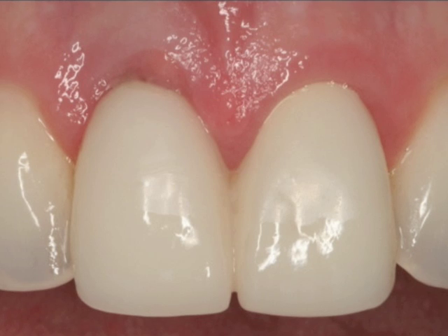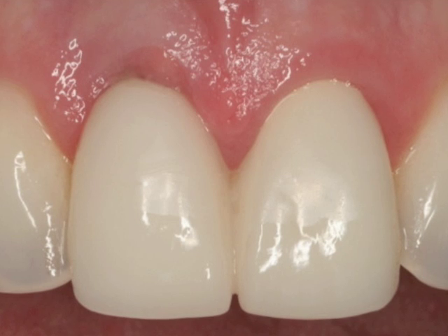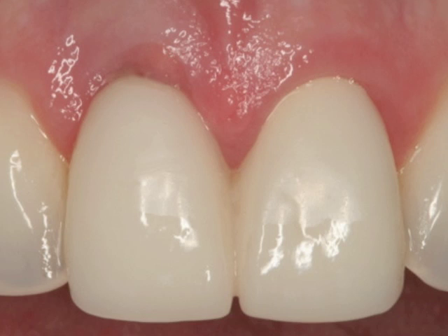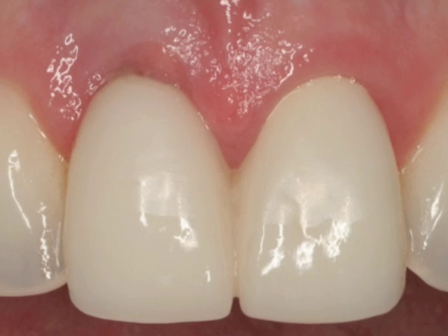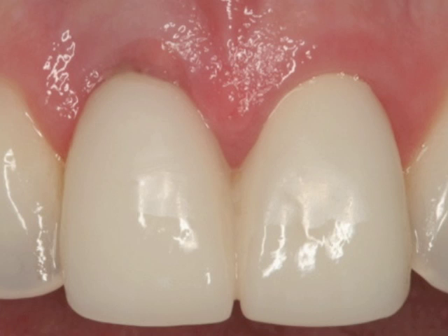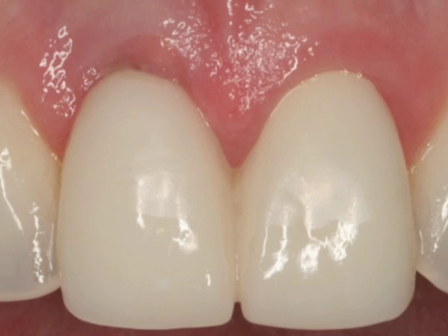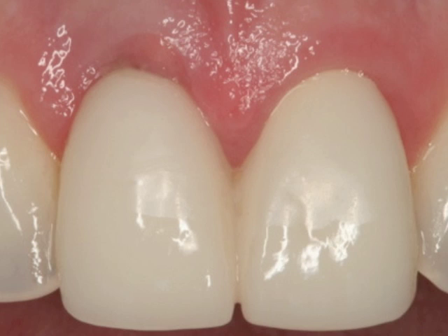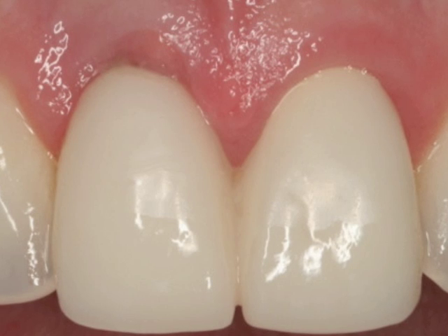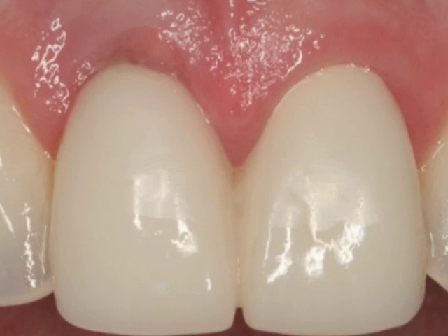We want the tissue to look like the adjacent tooth's gum tissue. So the contours of the temporary restoration are specifically made to be identical to the adjacent teeth, and therefore the gum tissue will heal to exactly duplicate the adjacent teeth. We like to let that set for at least two months — one reason is to allow the implant and bone interface to grow with each other, and the second is to allow the gingival contour to fully mature before we take impressions for the final crowns.